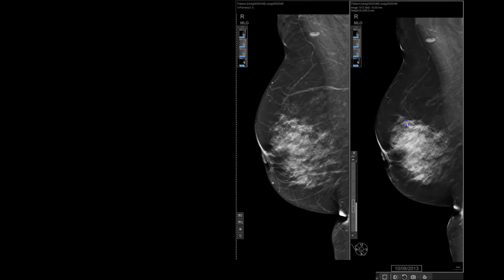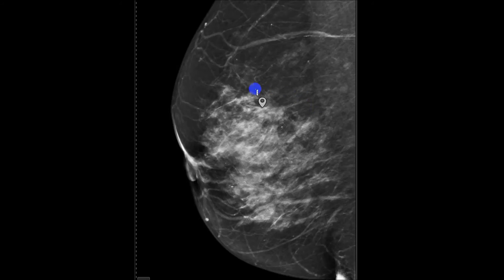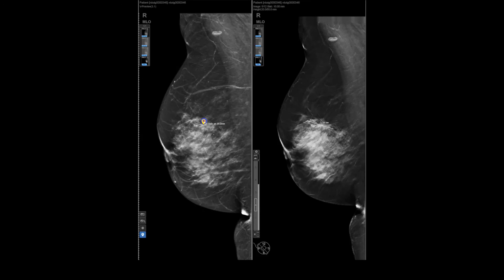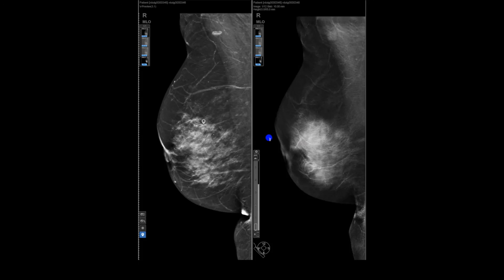There's one other feature: if we make an annotation on any of the planes and slabs — so let's say I find this spiculated mass, which is pretty obvious over here, and make a circle around it — now automatically on the 2D volume preview image, it shows me an indication that there's an annotation and a finding. Any time I go back to this, it's going to have this marker, and I can click on it. Even if I scrolled off this slice, if I click on it, it's going to go back to that specific image, either plane or slab, whichever one has it.